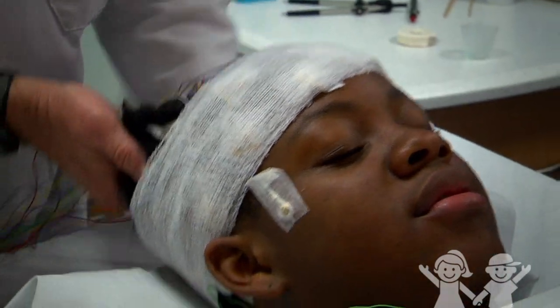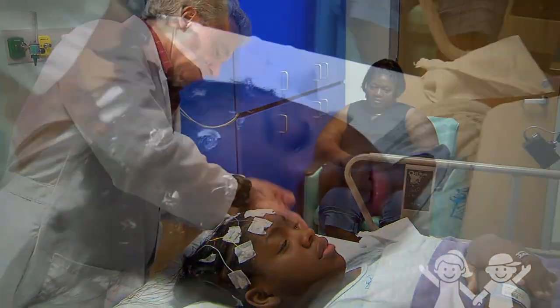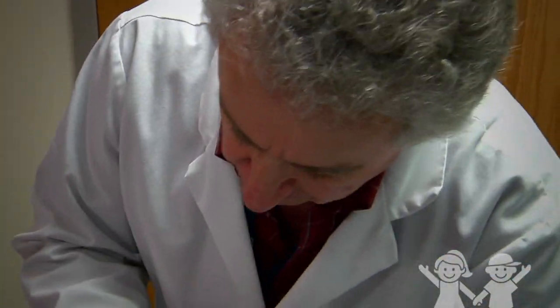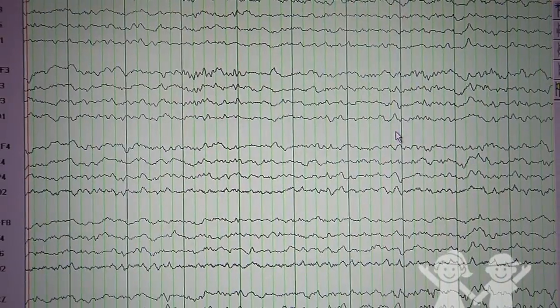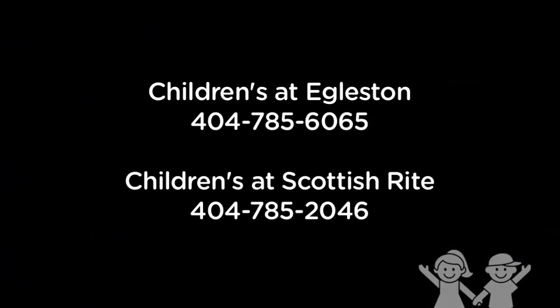Once the technician gets all the data he needs, he will take off the gauze and sensors. All the gel from the sensors will still be in your hair, but it will come off when you wash your hair with regular shampoo. Your doctor will get the results of your test in about 3 business days. Tell your doctor we are happy to talk with him or her about the results of your test. Thank you for choosing Children's Healthcare of Atlanta.